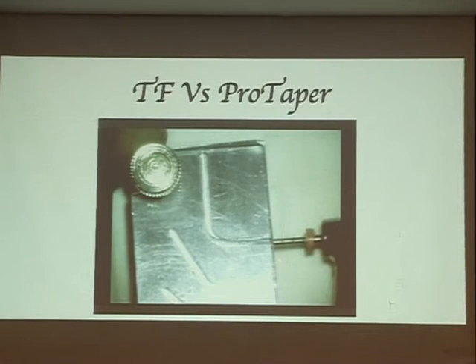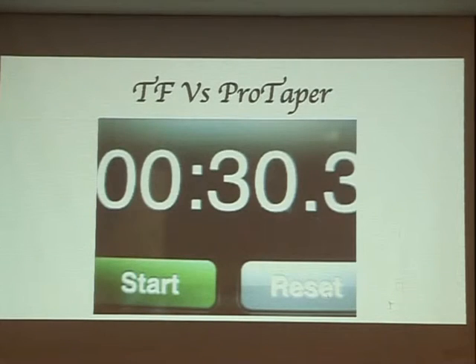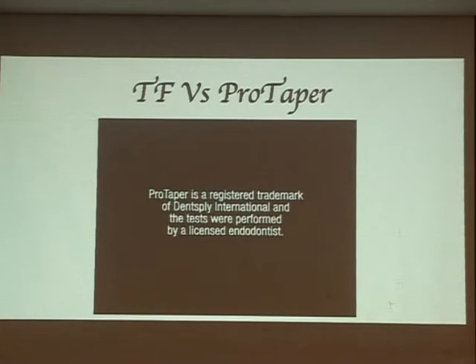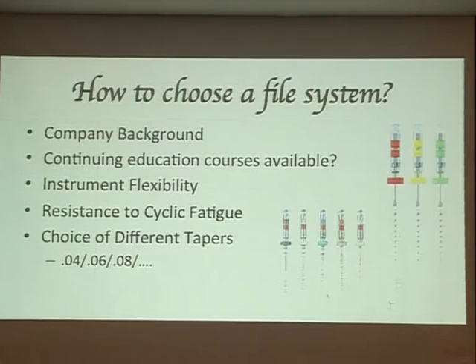No editing, it's real life, okay? Okay, separate. So, I would like to give you a message. All files will separate, whatever the manufacturer. If some sales reps tell you their file never separates, there is only one condition: never use it, okay? So, if you can find a file that's stronger, that will be the choice.